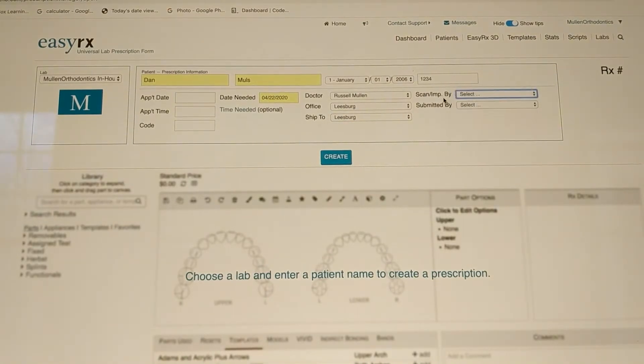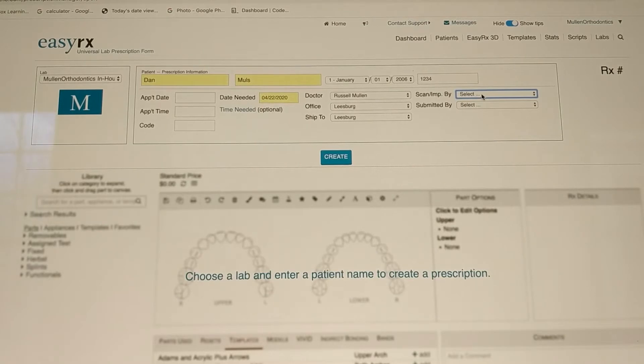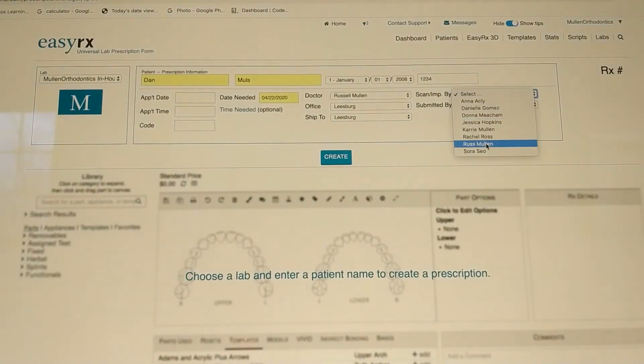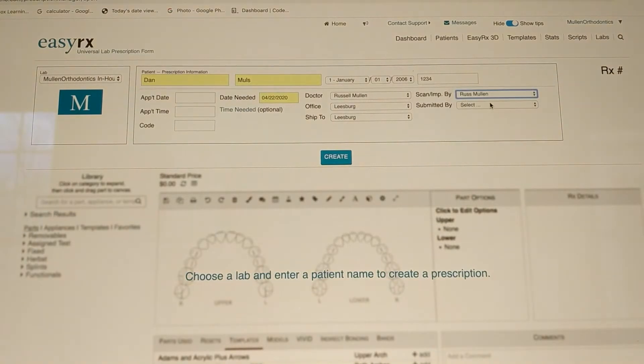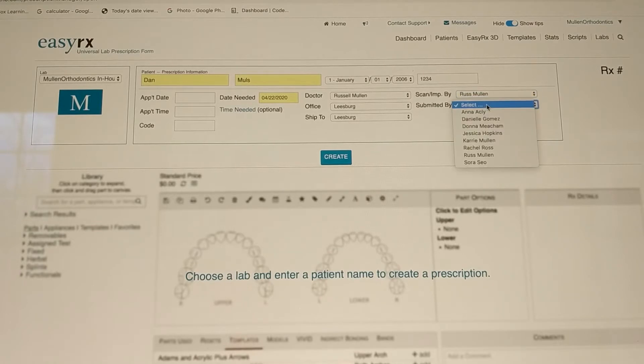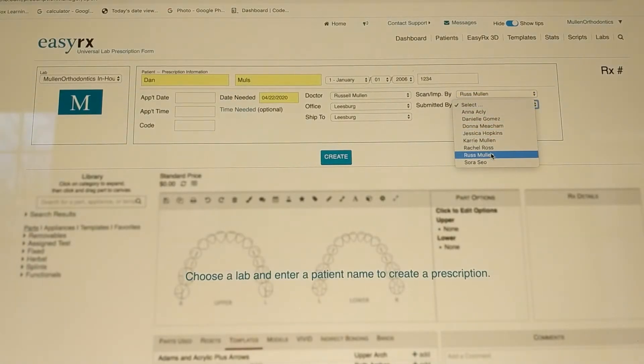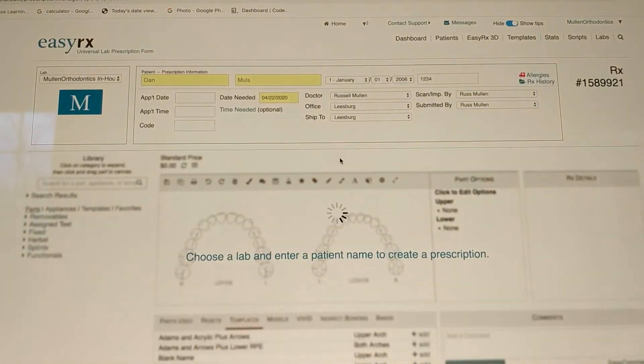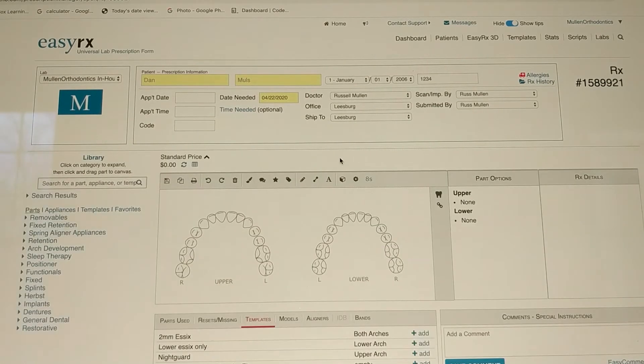This is, so the scan or impression by. This is a list of your staff who may have taken the scan or the impression. So this is me. Submitted by. In our office we use this. Who is actually doing the prescription. So also me. And create. Just click on that.